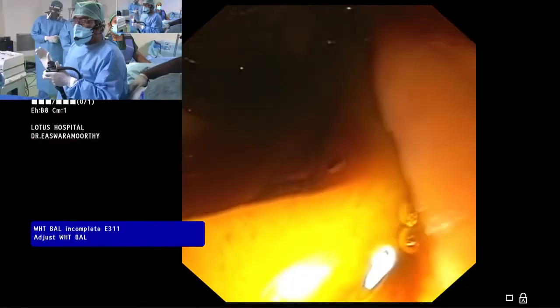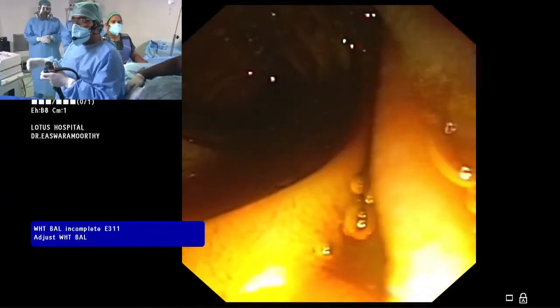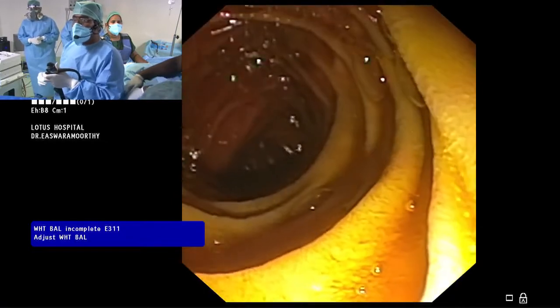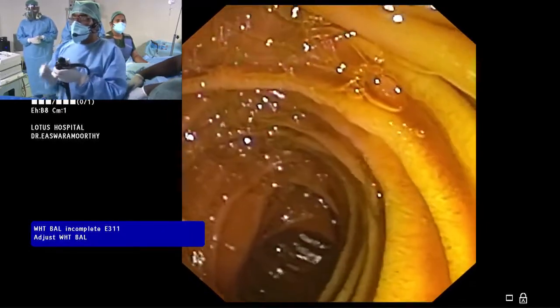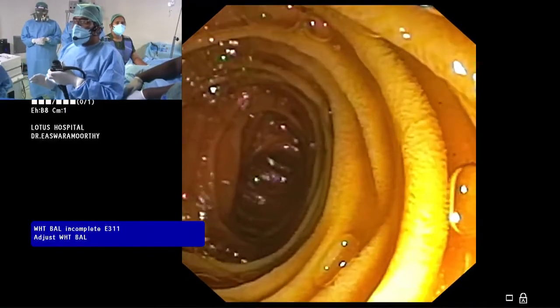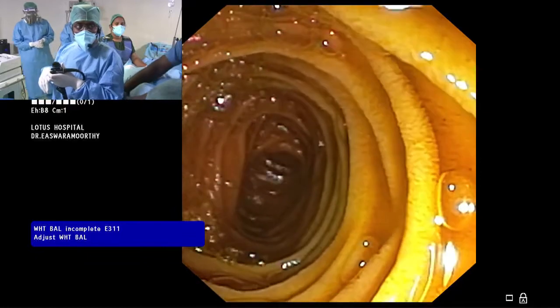And there is a lot of bile, because what I did in this particular case is, I was squeezing the bile duct as we were dissecting the gallbladder. If there is any stone, it will come out. So that's why there is a lot of bile, more than what you normally see. I'm just at the junction of the second and third part. I have to come back. Now is the time for my radiographer to come in. So raise the table, keep the patient.